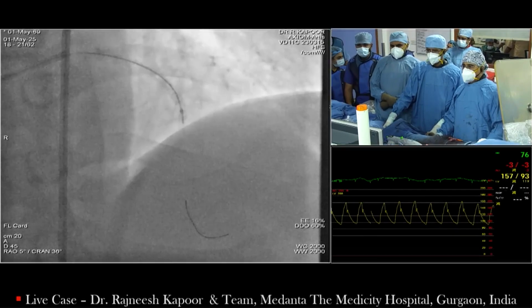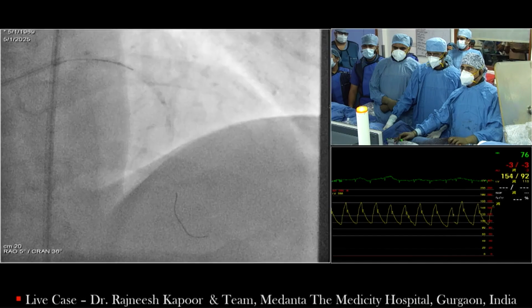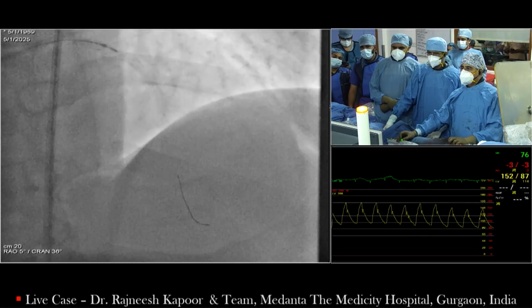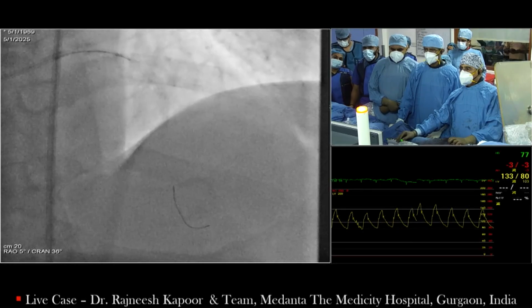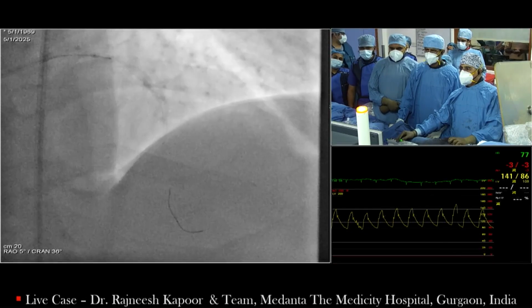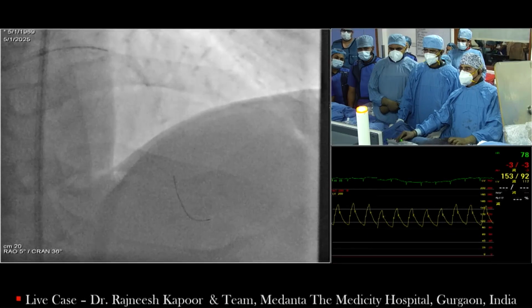So this is the point that actually gave way, and now we are coming back and doing the whole length of the vessel with the orbital. It's retrograde sanding we are doing around the ostial, because the thickness of calcium was quite severe at that point.